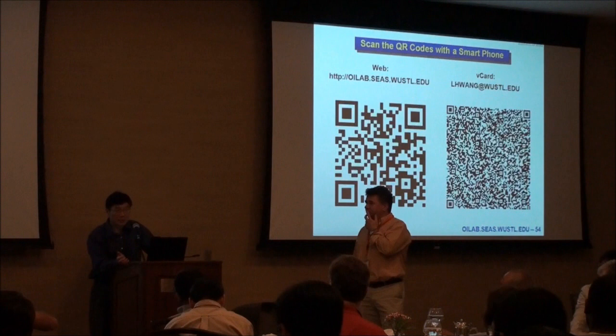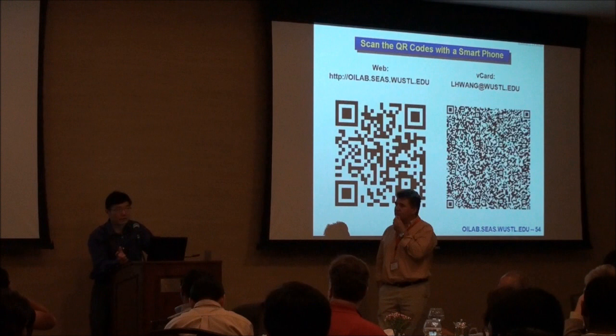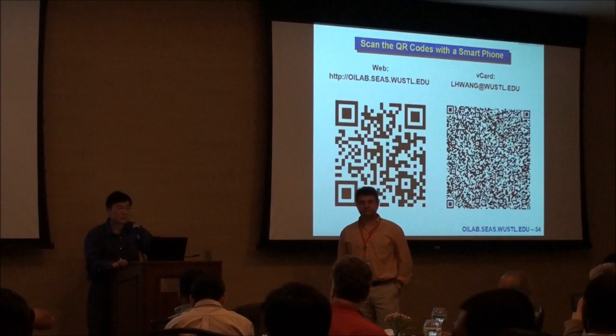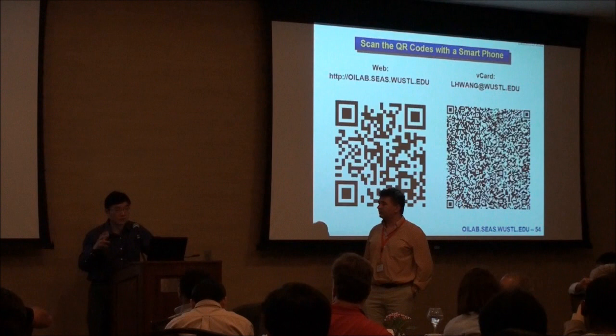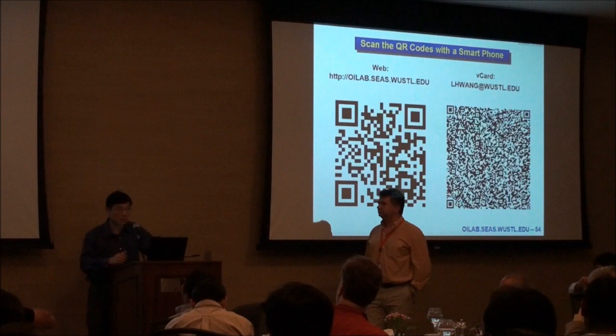And we have another version that works at 5 to 10 megahertz that allows you to penetrate 10 times as deep. But your resolution will also scale by roughly a factor of 10. Remember we plotted depth versus resolution, it's roughly linear, which is not available in every technology. So this is actually quite unique. It's enabled by the ultrasound scalability. In the clinic, you use low megahertz for deep penetration imaging, and then there's also very high frequency for shallow penetration imaging.